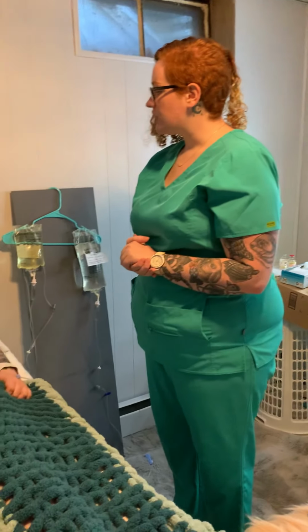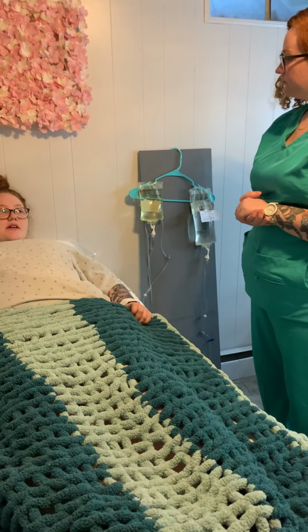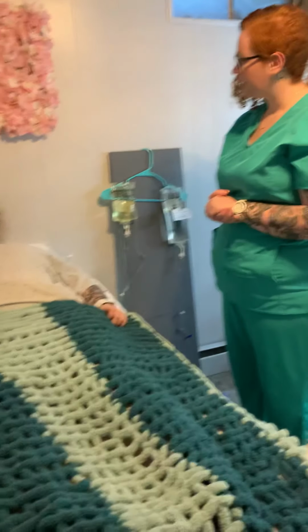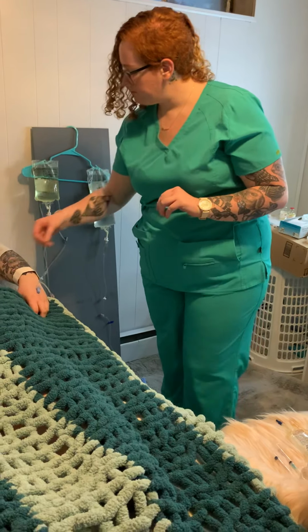Hi, I'm Hannah. I was just in here doing your IV assessment, and if you could just give me your name and date of birth one more time. Yes. Ruth Peer, 12/20/62. And do you have any allergies? No. I will just scan your name band at this time.